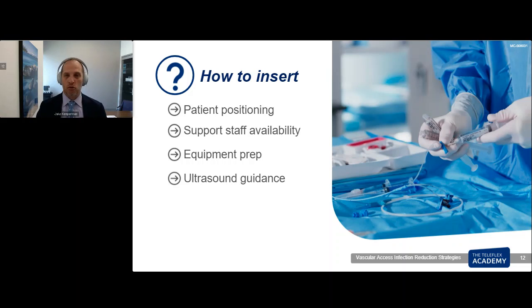And next, use ultrasound guidance. The Institute of Medicine many years ago came out with very clear guidelines that we use ultrasound guidance for placement of central lines. Sure, it's not always easy to use ultrasound for subclavian line guidance, although there are multiple published studies demonstrating how to do it.